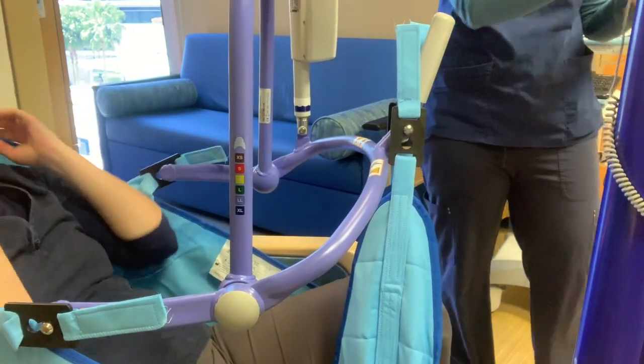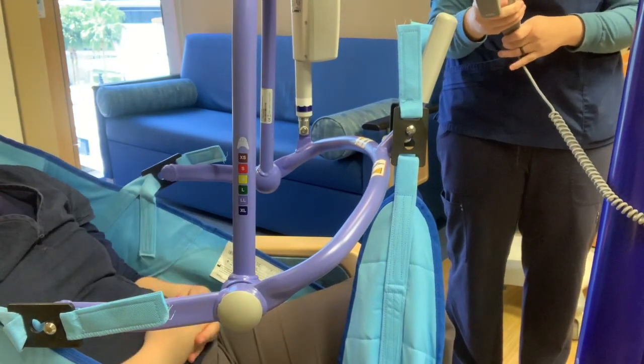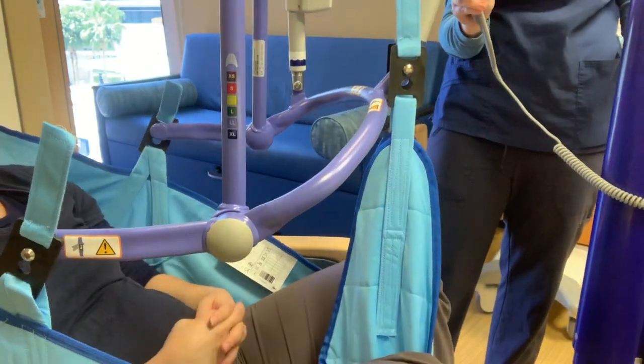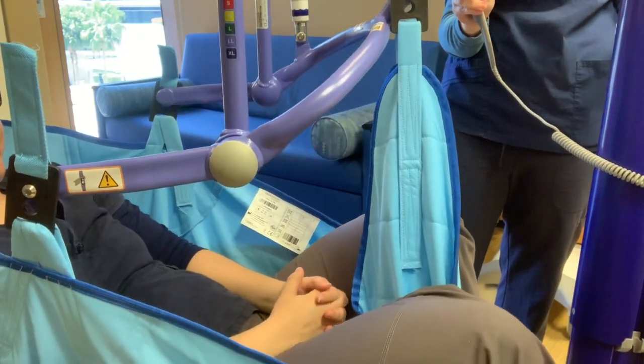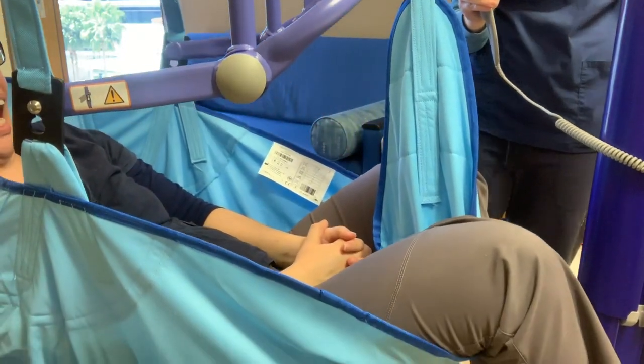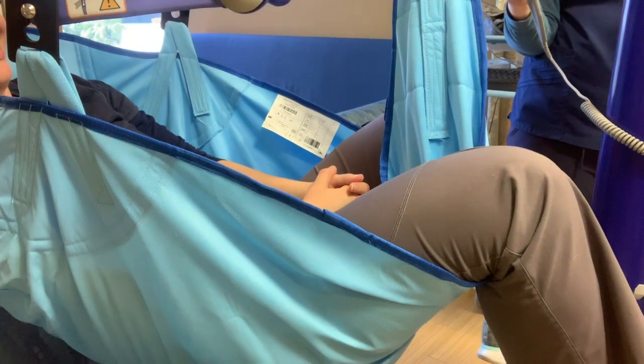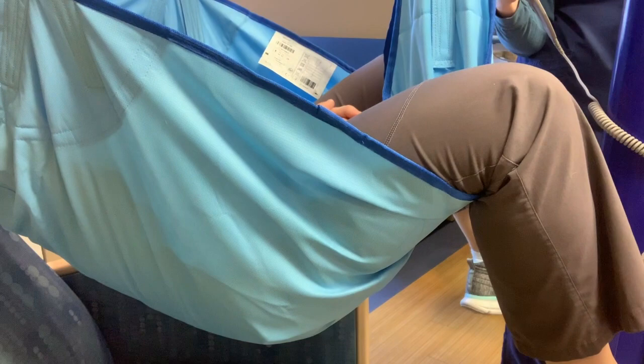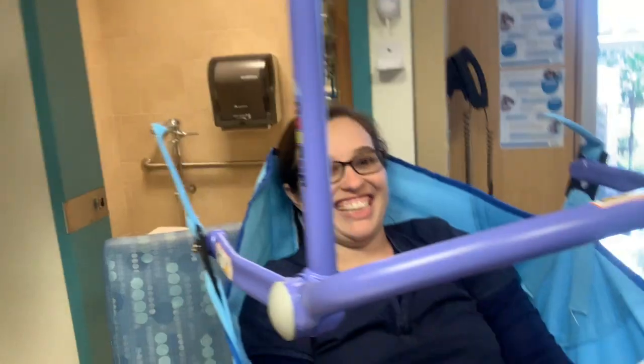After your patient is securely in the sling, you can push the up arrow and start raising them up. Then you can also tilt them down or upward if needed to reposition them.